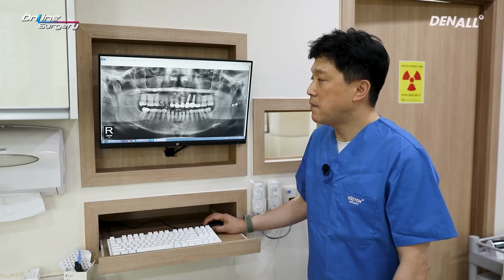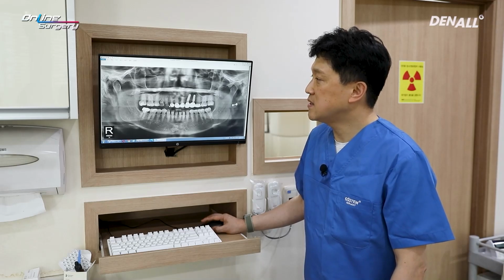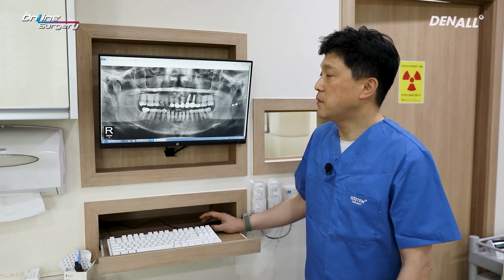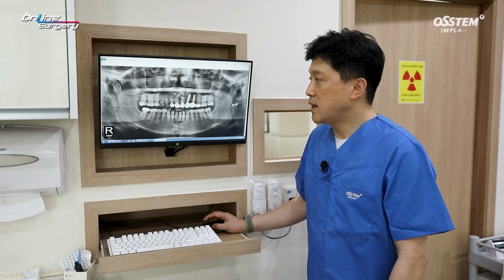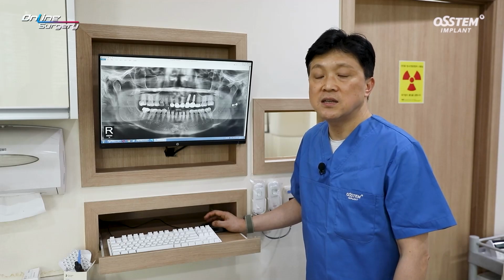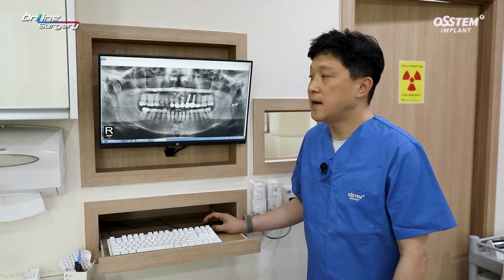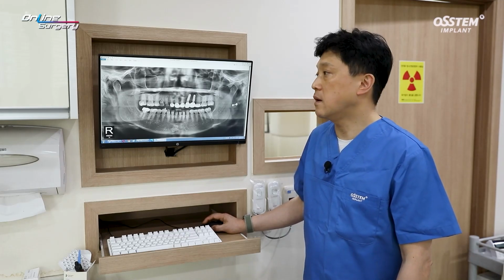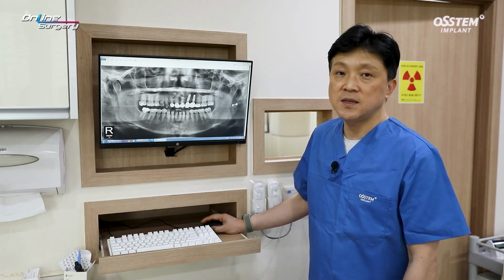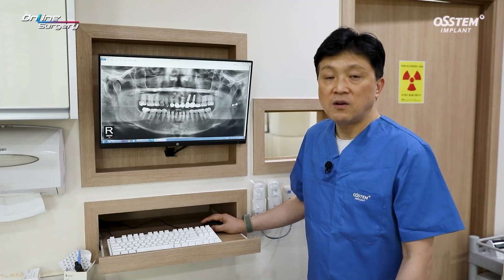The patient complained of pain in the number 54 and number 14 tooth area. We could not wait longer, and implant placement was decided. When we come across this kind of patient, where permanent teeth were congenitally missing and there were prolonged retained primary teeth, the bone may be immature in a lot of cases. You can anticipate a thin ridge, and there can be difficulty in implant placement due to horizontal bone insufficiency.